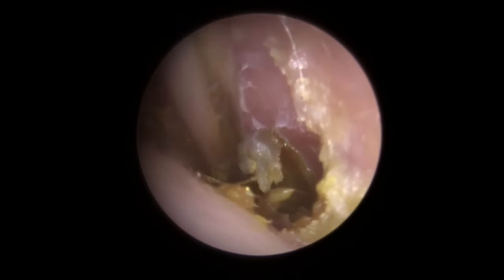I've got no room in here — it's really, really difficult. If you've ever seen me do a peel before, you know we can peel from top to bottom or from left to right. But there's such a small amount of space here, we can't get the movement we need to get a really good peel. So what you'll see with the ear canal — it's very narrow at the top section and wider at the bottom section here. A very elongated shape and also twisted across to one side. I'm going to magnify this section — that part is the eardrum, so we're actually peeling directly from the eardrum. We have to be so, so careful in here.